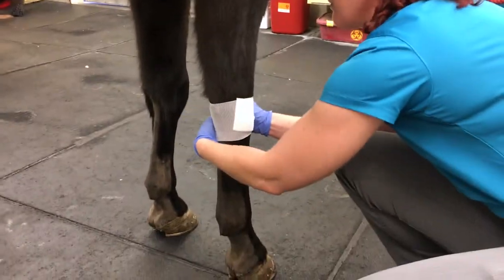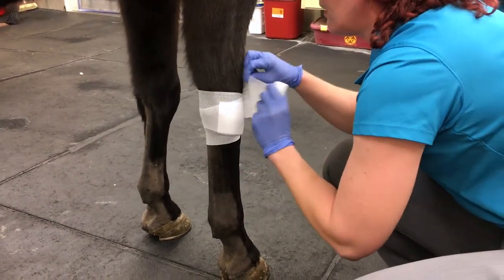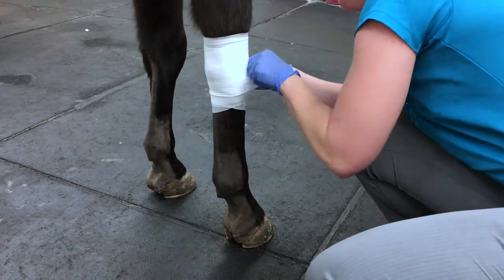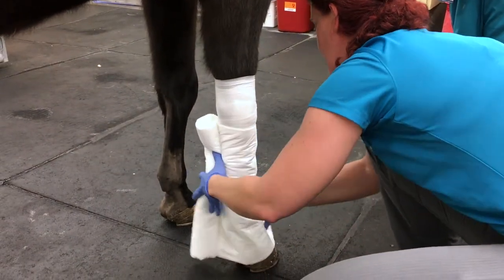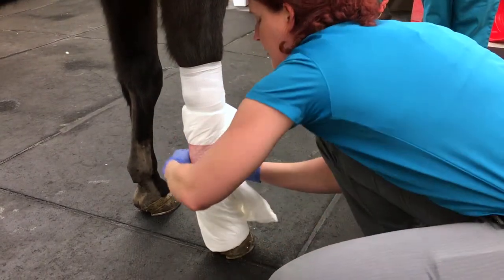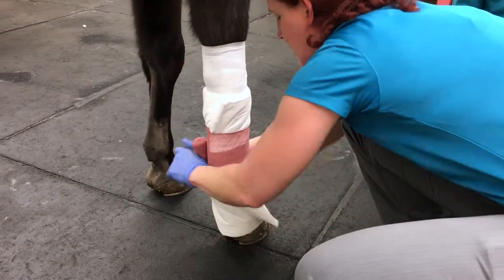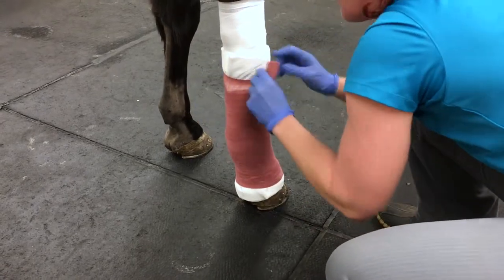Apply the telfa with the white cling to your area that's being bandaged — in this case, the carpus. Apply your first combi roll to the bottom of the leg, taking care to do it at the level of the hoof, then apply your brown gauze firmly, taking care to avoid wrinkles. You do not want your brown gauze to touch the skin or go over the top or the bottom of the combi roll.